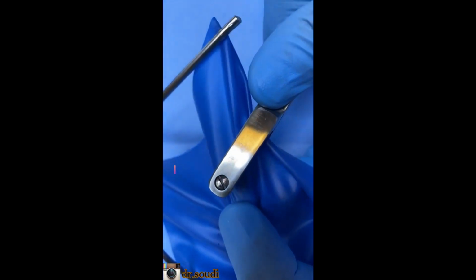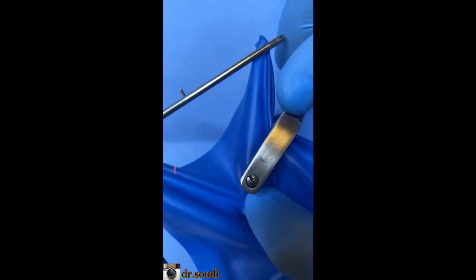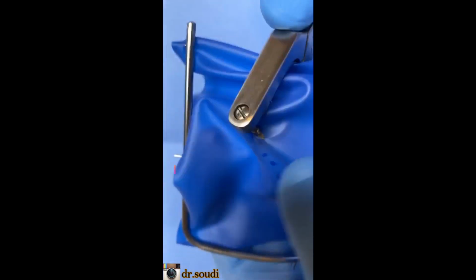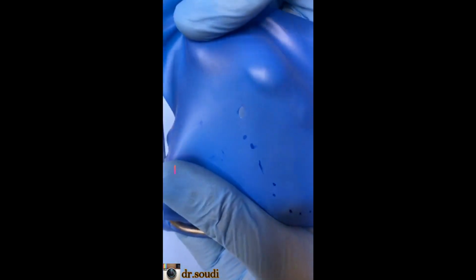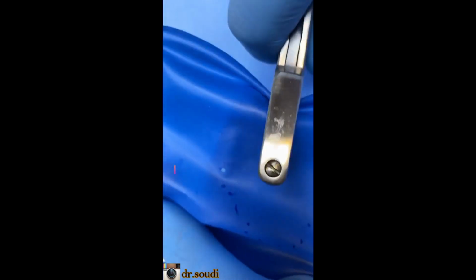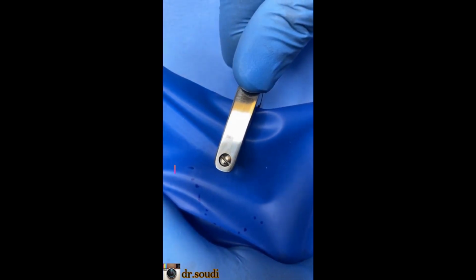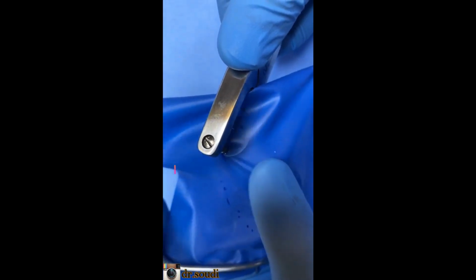and when you press, if you can see it's not completely cut, you should cut it, free the sheet all over the stylus. You should free your hole, okay, to have a uniform hole. To have a uniform hole like this, you should do like this again. I will do a hole in another place like this until you hear this sound, chick. It means cutting. When you hear this, you should free your sheet.